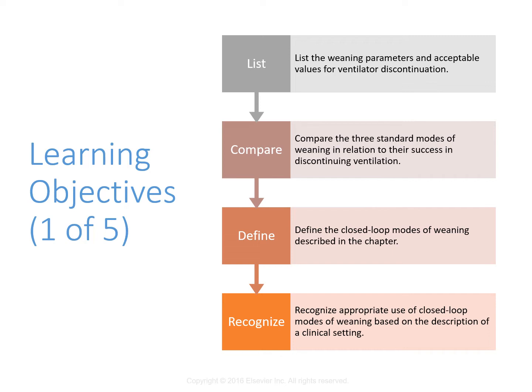become off the ventilator. So let's say someone has CO2 retention and they have really high CO2s at baseline. Are we going to wait till their CO2s are perfect in a wean before we extubate them? No. What if someone wears a lot of oxygen at baseline? Let's say they wear 6 liters nasal cannula at baseline. Are we going to wait till they're on just sort of room air numbers or 30% oxygen before we extubate that patient? No, right? So this is going to be something making sure they get back to their baseline. But do know acceptable parameters, that includes your RSBI, that includes patient awareness and all that. So think about your baseline stuff.